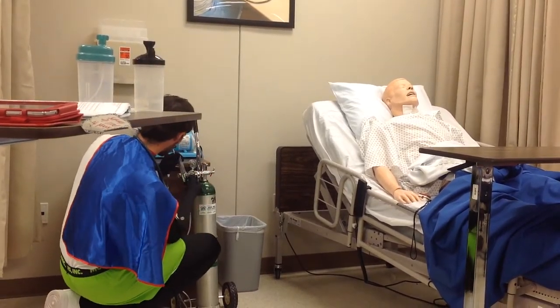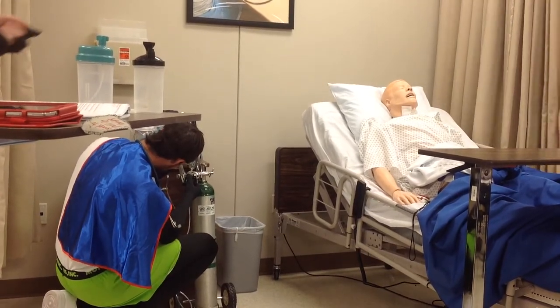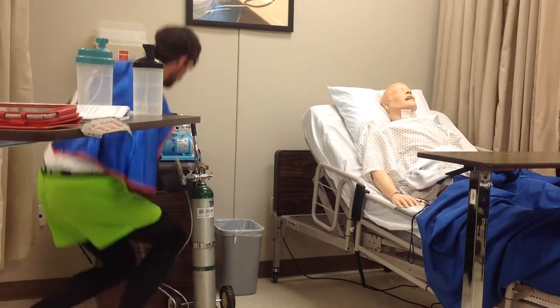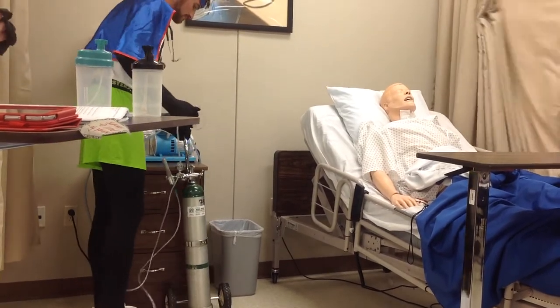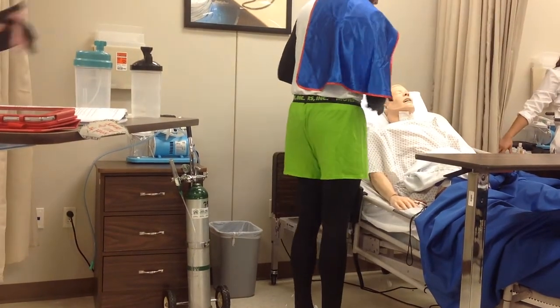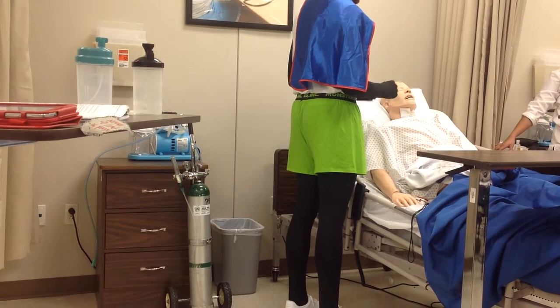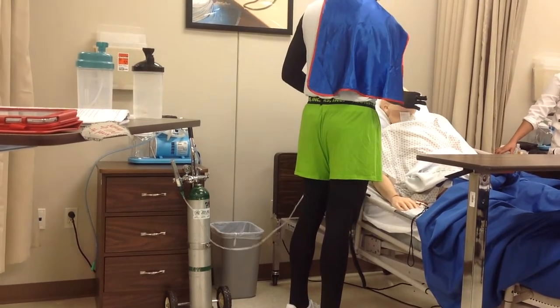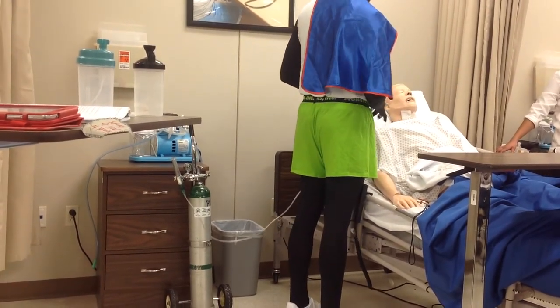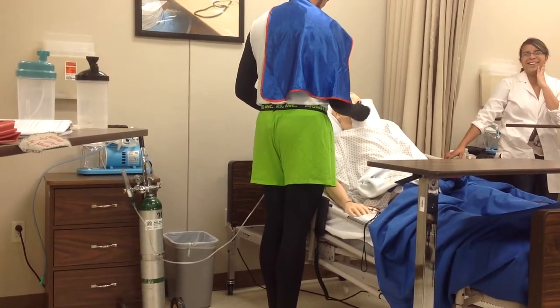And you always want to have your oxygen on before you even think about putting it on your face, because you don't want to put it on and them not be getting anything, and because it could maybe suffocate them. So he turns that on. First thing he's going to do, he's going to check for skin integrity, and you're going to want to look at the nares of both nostrils. Then you're going to want to check the cheek and behind the ears.